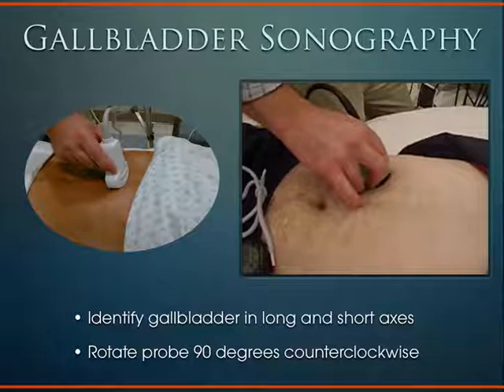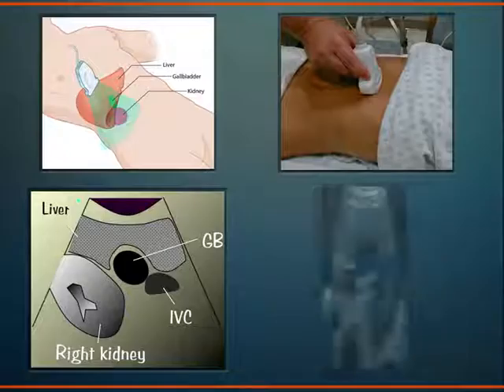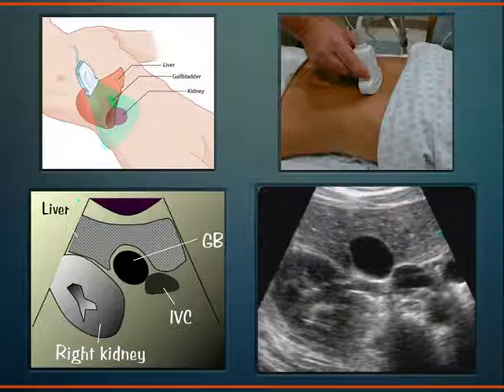And so it's really two views, and that's the idea in all of ultrasound, is to view things in two separate planes and then recreate that three-dimensional anatomy in your brain. That's the trick to all of ultrasound. Here we are on the transverse plane, and we've got a lot of circles on the screen. Once again, the most anterior circle, closest to the skin line, is the gallbladder. Here's the kidney, inferior vena cava, aorta is seen.